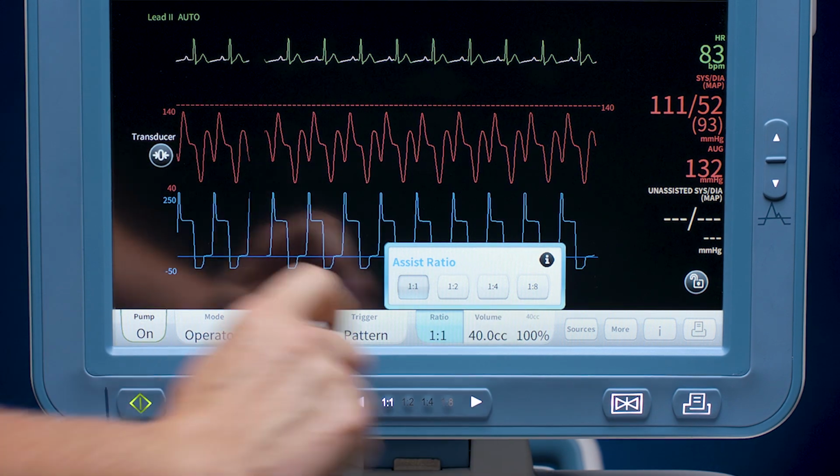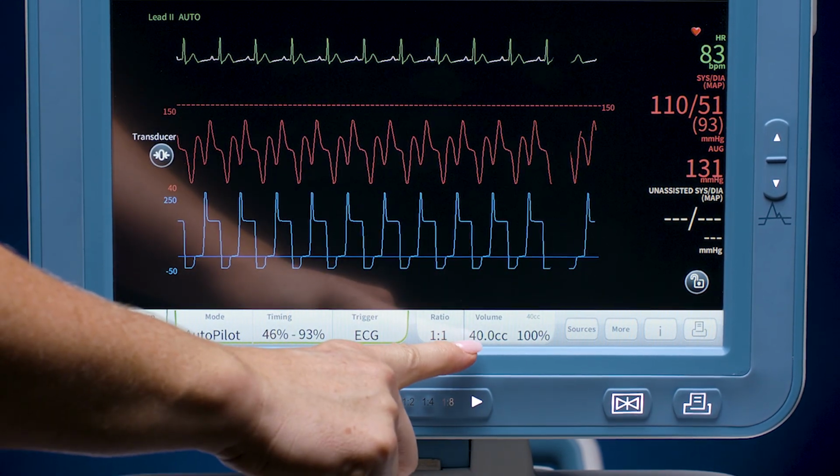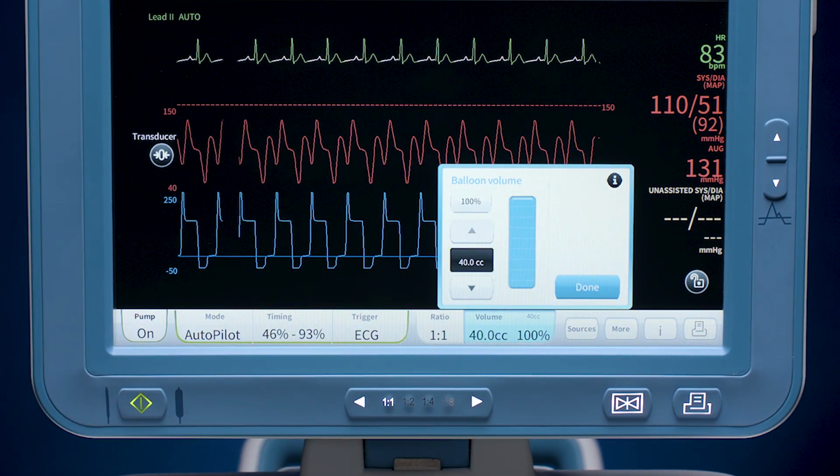The selection is highlighted. The AC3 Optimus IABP automatically sets the volume from the IAB connector. The connectors come with each IAB in the balloon insertion kit. When the connector is attached to the pump, the volume will be displayed on the action bar.